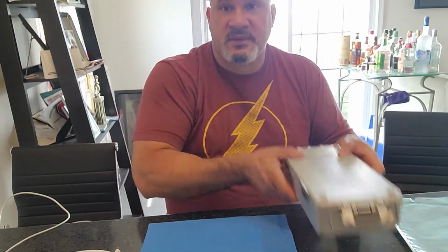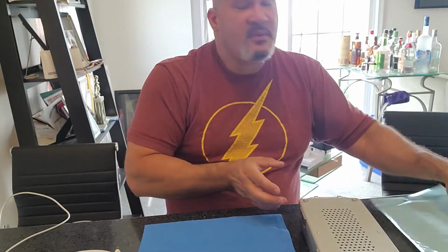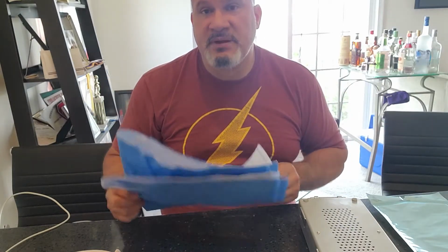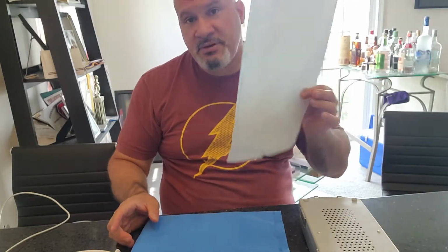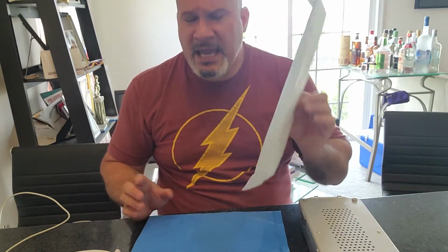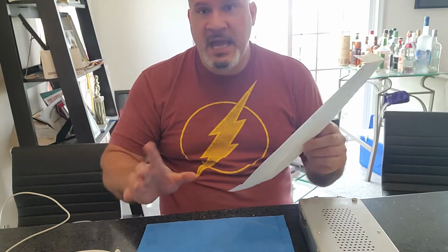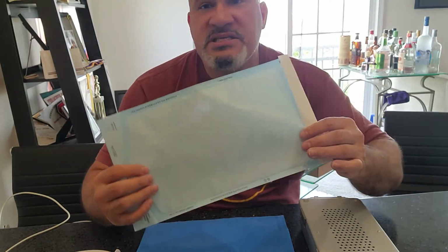Validated, validated, validated. Now, does the product fit? Or is it safe to be placed in it? Of course, you're not going to put a mallet in a peel pack. Can you put a mallet in a peel pack? Yeah, you can. You sure can. There's no reason why you can't put a mallet in a peel pack.